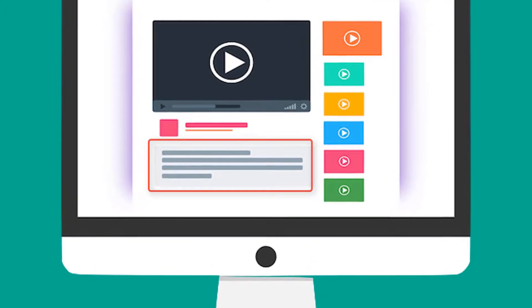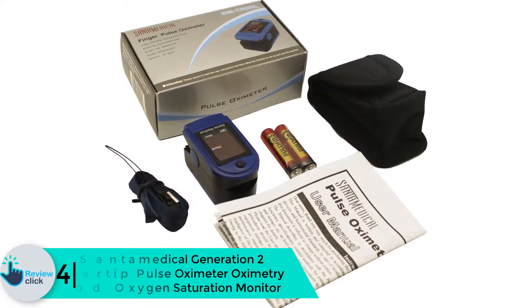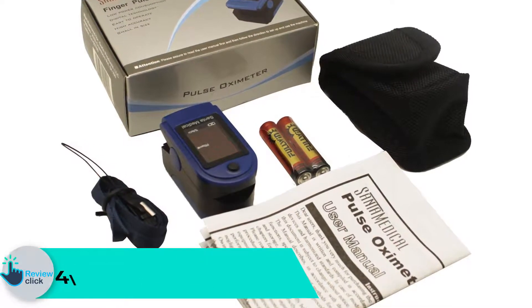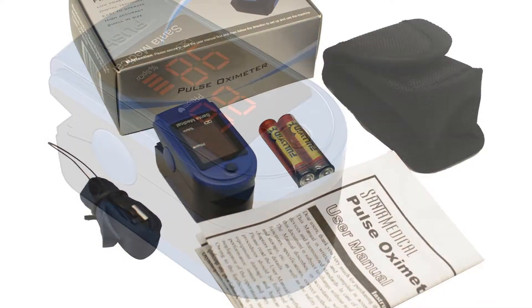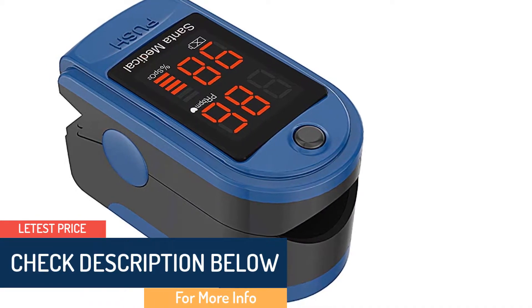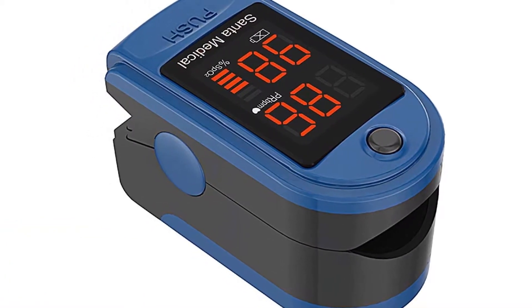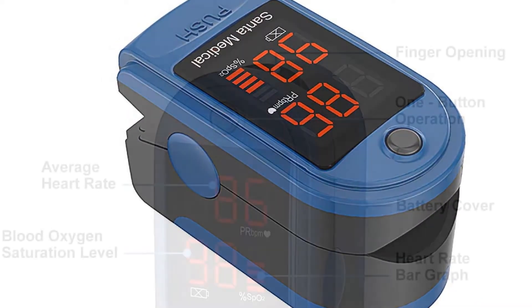The oximeter is safe and doesn't pressurize your finger, making it the ideal choice for kids, adults, and the elderly. Moving on, at number 4 we have the Santa Medical Generation 2 Fingertip Pulse Oximeter. Determining blood oxygen level is simple with no need to visit a health facility. This compact, lightweight, and accurate oximeter from Santa Medical boasts a large OLED display with adjustable brightness, easy to read under both low and high light conditions.